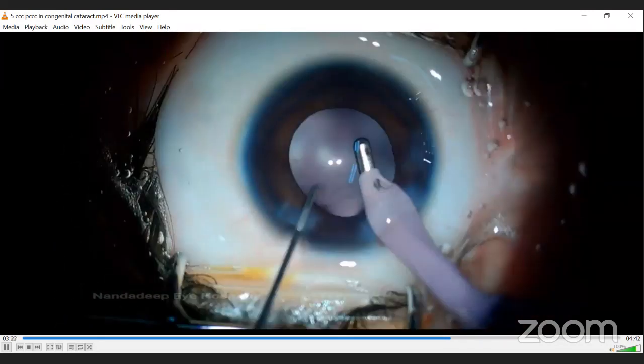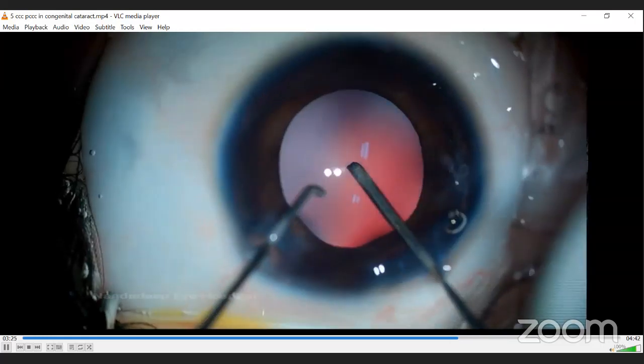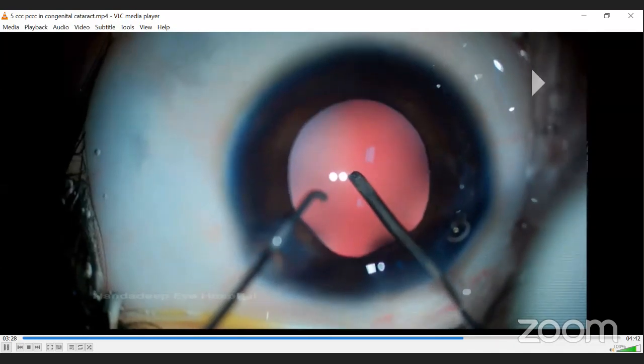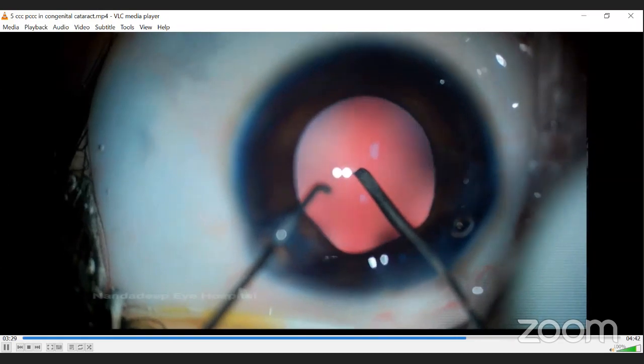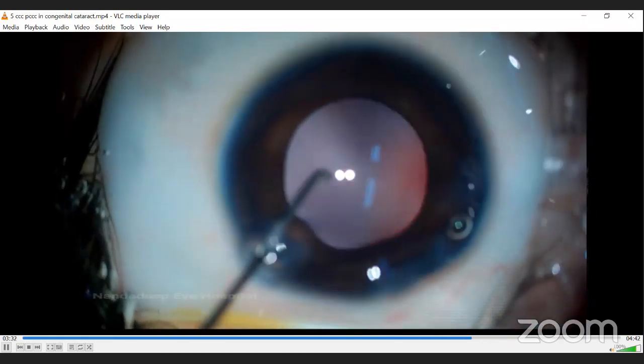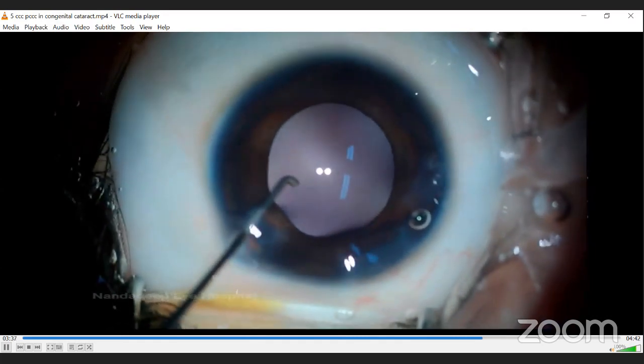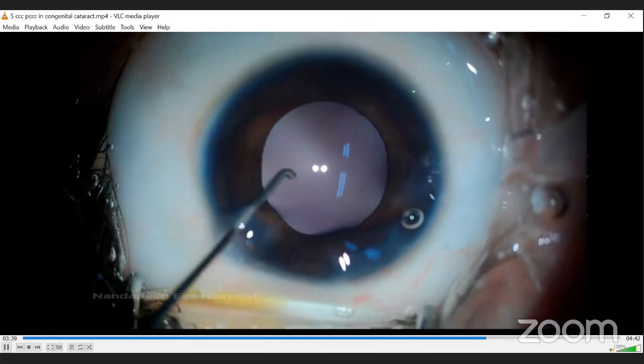Another technique that is used in pediatric cataract is posterior capsulorhexis. And interestingly, it is easier to do than anterior CCC in pediatric cataract. The main principle that you have to stick to is that always keep the anterior chamber well maintained, and the posterior capsule should always remain concave. That's the idea. So I have made a small nick in the posterior capsule here. You can see the small nick here.